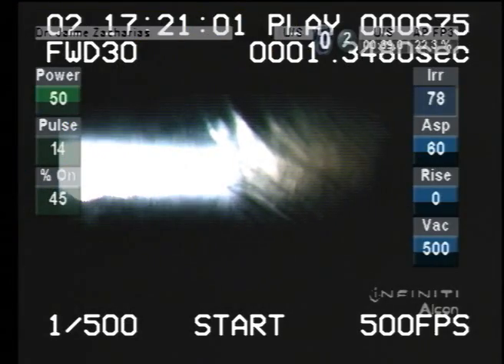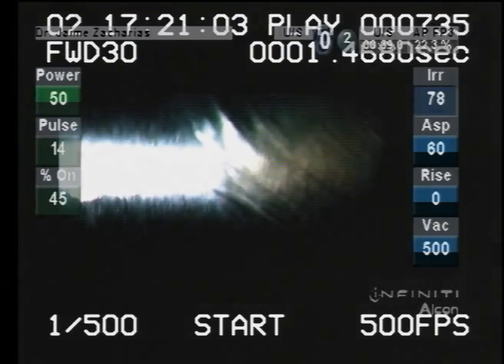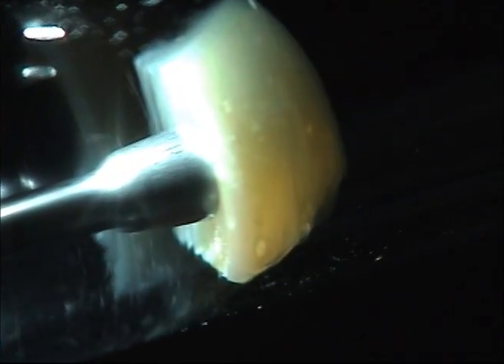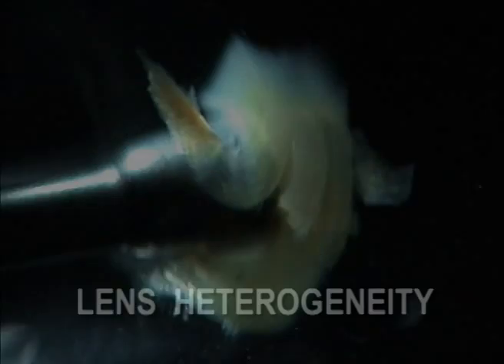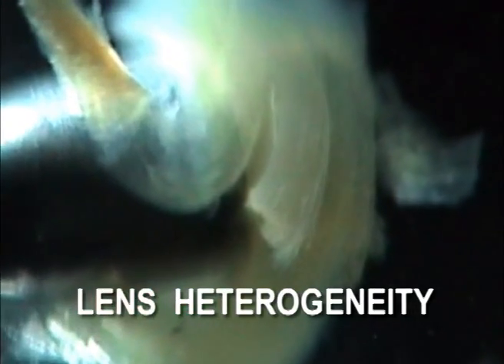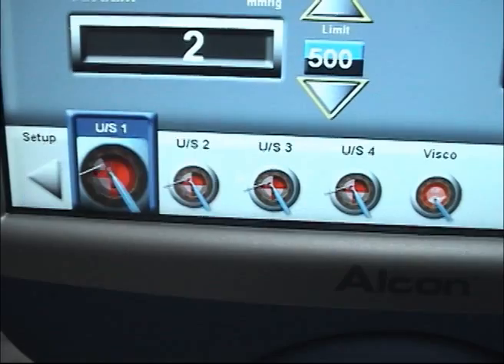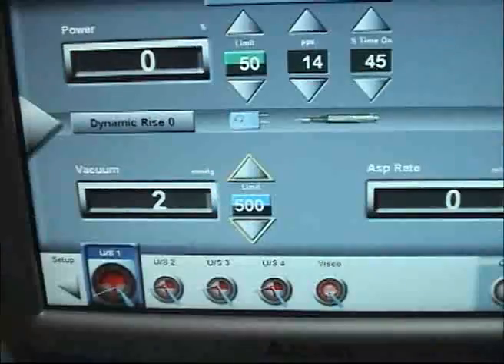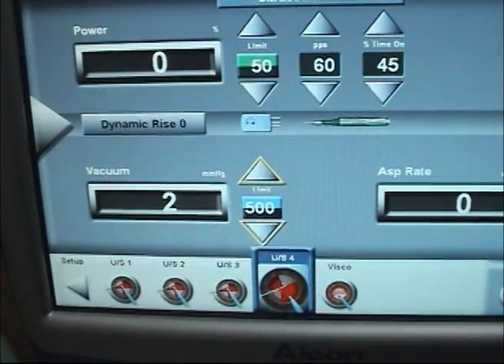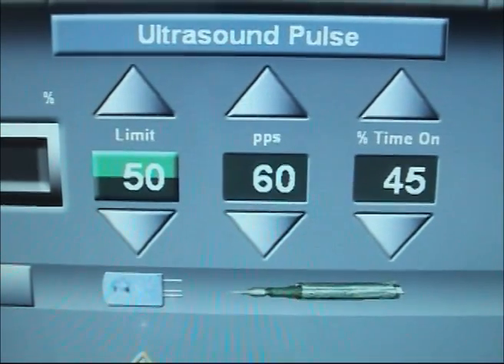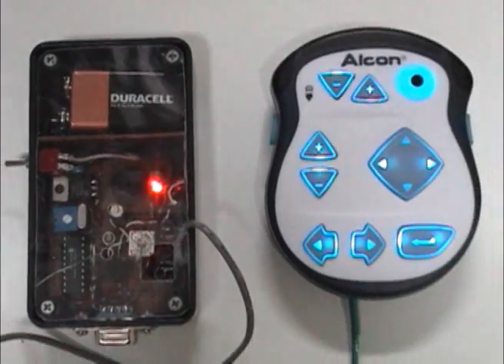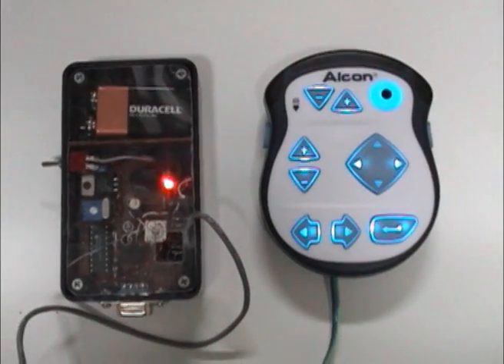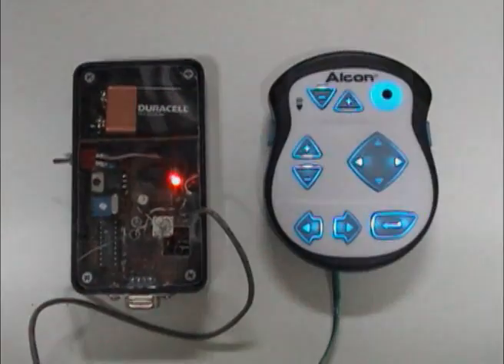We performed high-speed video recordings of the tip-tissue interaction in occlusion mode with human cataracts. Considering the heterogeneous nature of cataracts, we devised an intrinsically calibrated method by rapidly alternating hyperpulses and standard pulses. This process was performed using a custom-designed controller on command of the remote control unit of the FACO console.